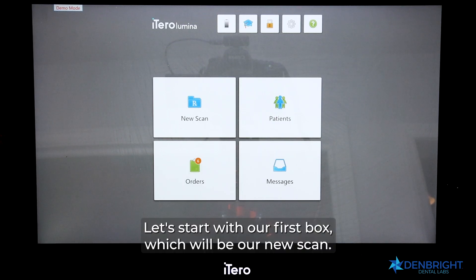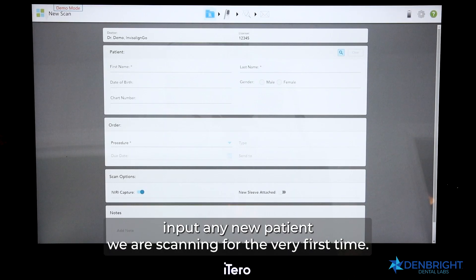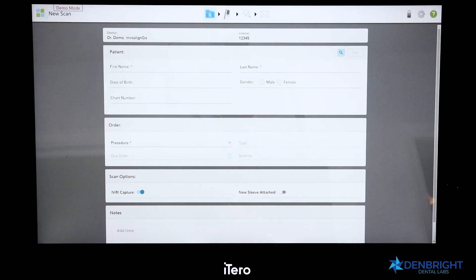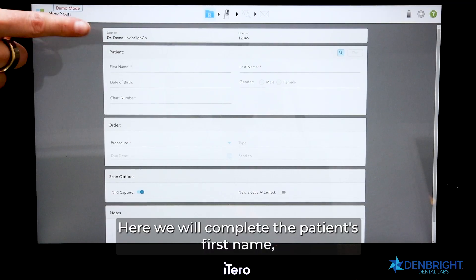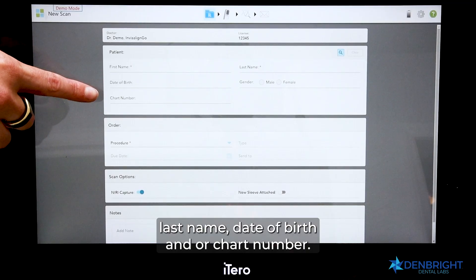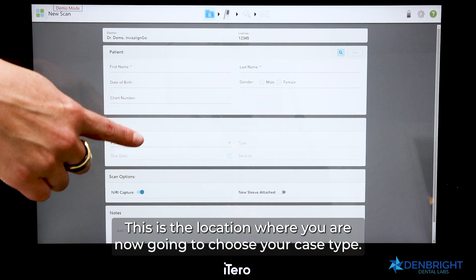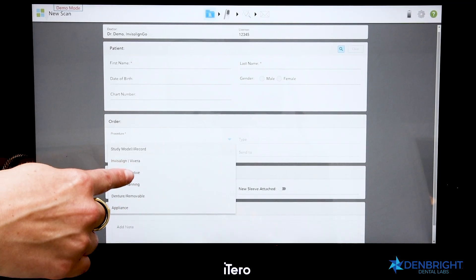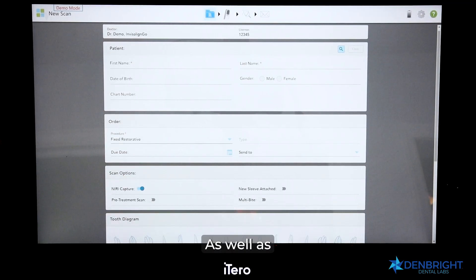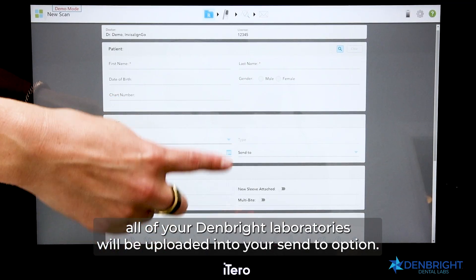Let's start with the first box, which is New Scan. In New Scan, this is where we will input any new patient we are scanning for the very first time. Here we will complete the patient's first name, last name, date of birth, and/or chart number. This is also where you choose your case type — for example, fixed restorative.